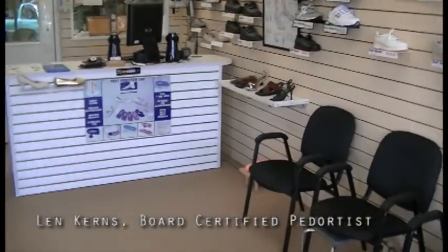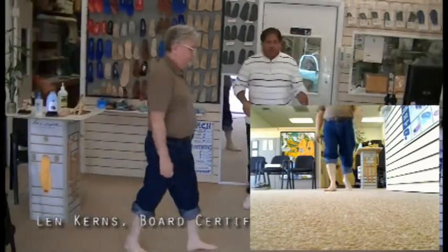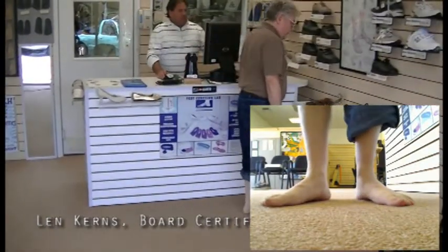before he treats them. Okay, once again, the camera is located on the floor about 14 feet away from the patient's feet. They're going to walk about 12 feet up to the camera and stop. So demonstrate that for us, please. Recording video right now. Okay. So now Len's walking along at a nice slow pace, and he'll tell me stop right there, and even up both feet.